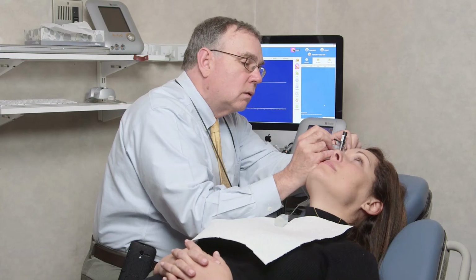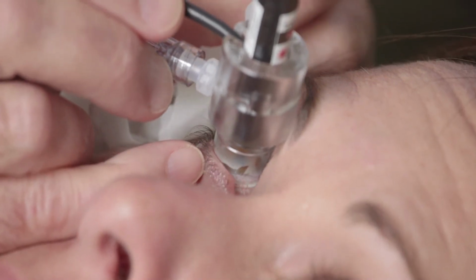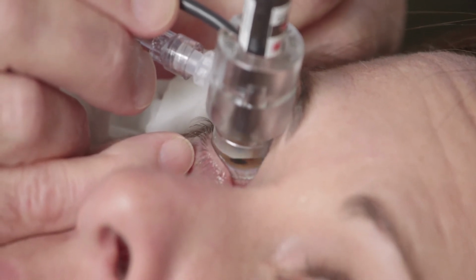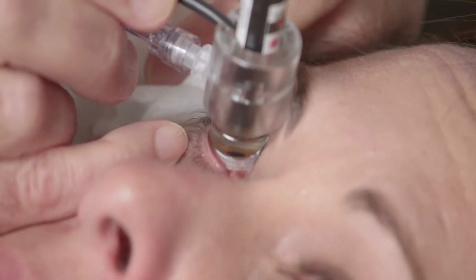The immersion technique is generally considered more accurate for axial length measurements since the cornea is not compressed. A small shell is placed beneath the lids and filled with coupling medium such as methylcellulose, and the probe is immersed in the liquid close to but not touching the cornea. This technique involves a slight learning curve.